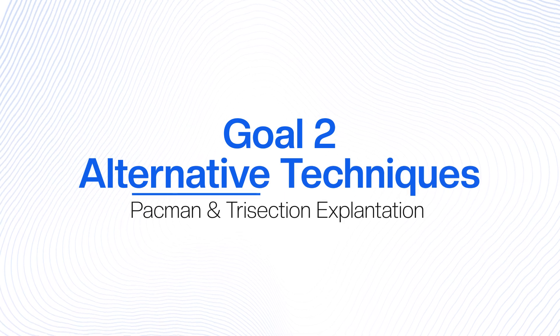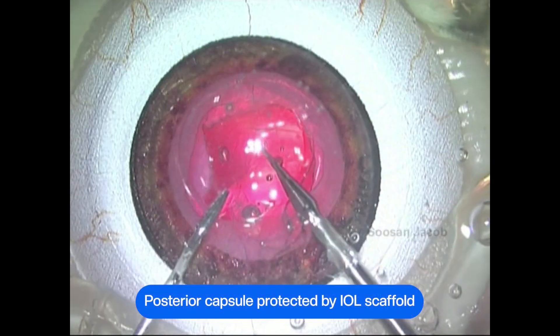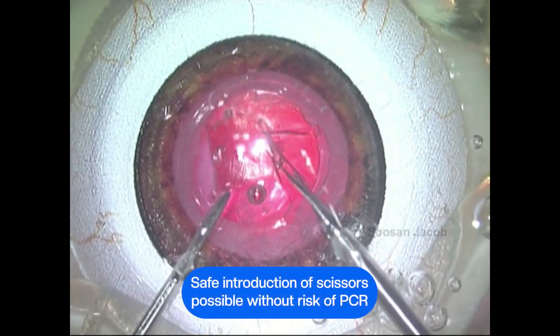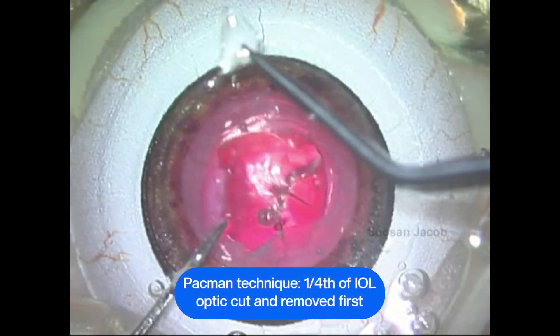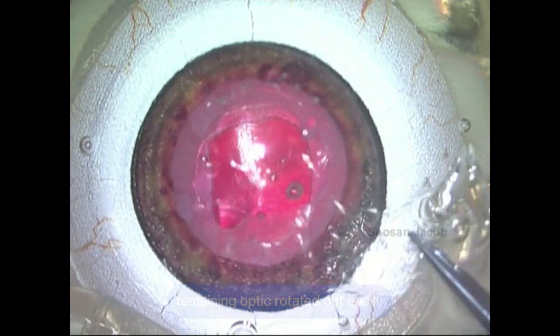This is a really beautiful technique and I went through the paper by Debgan, Rahul Pandit, and Chapman et al. I was so interested by this and I was wondering to myself whether this would be an easy technique to do for the first time in the eye, and whether I would end up hurting the endothelium.